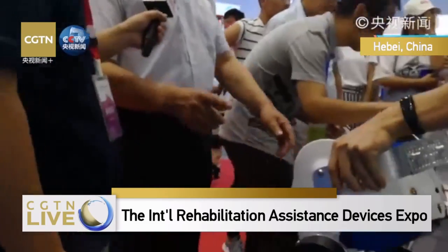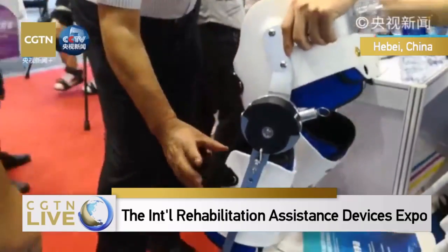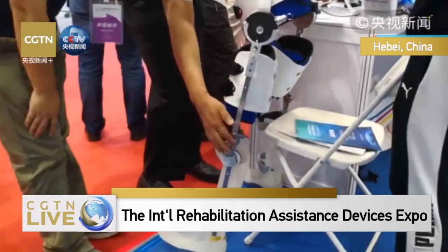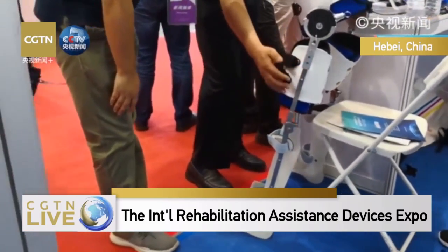We have a lot of exoskeleton products. For example, this is where the patient's legs go.